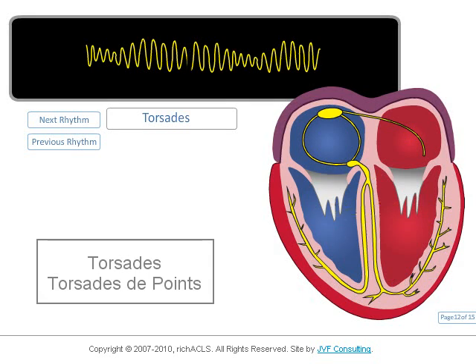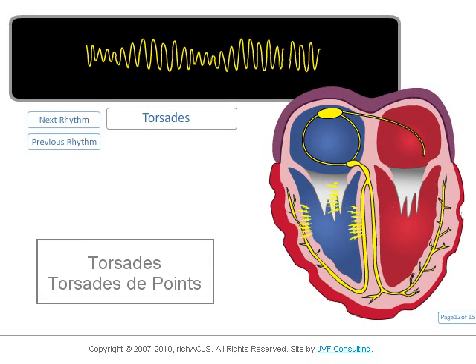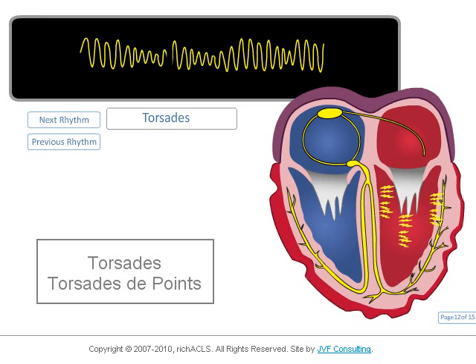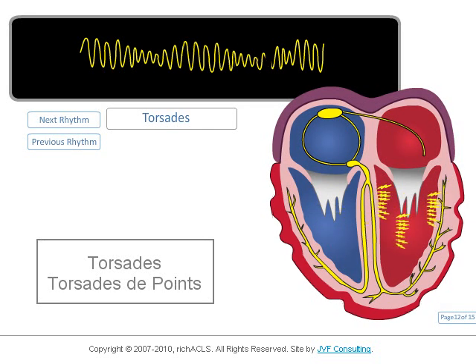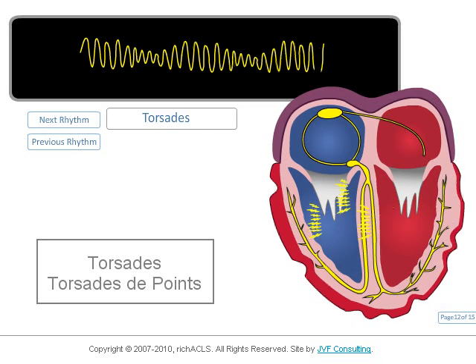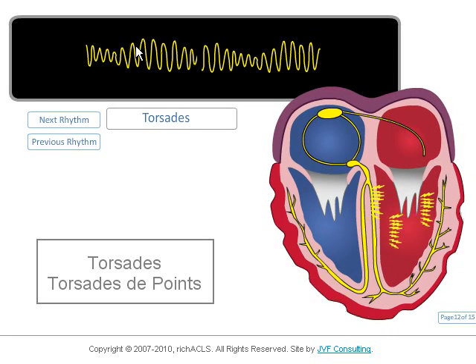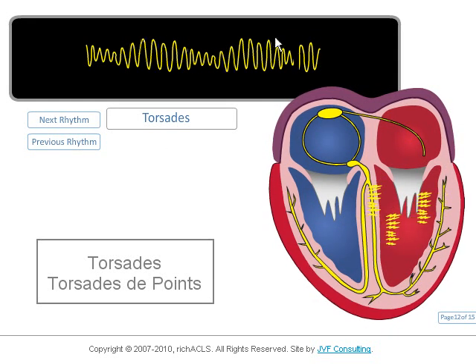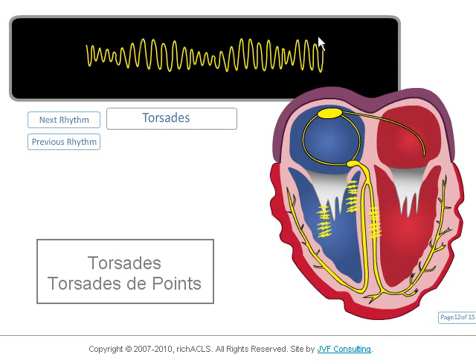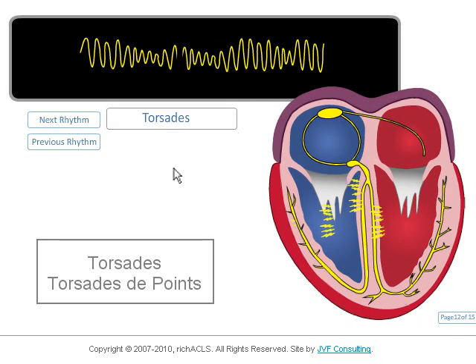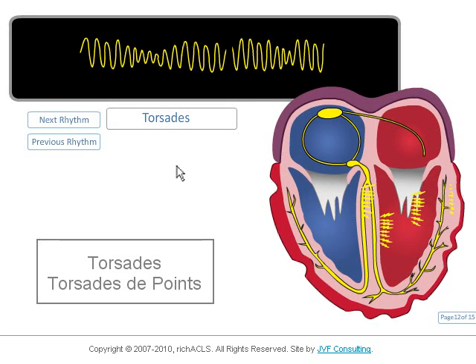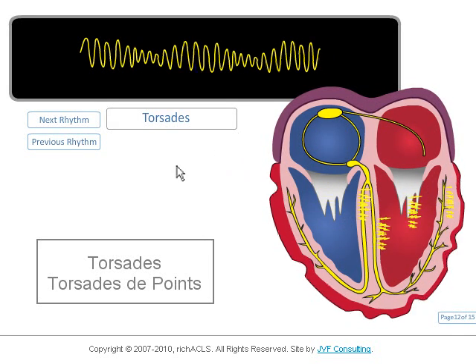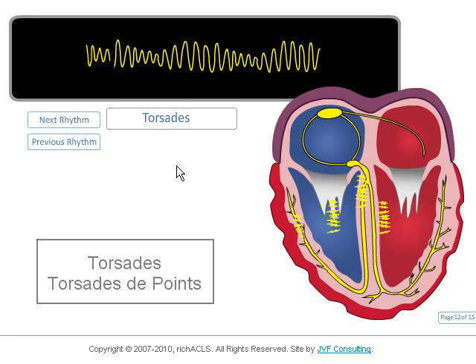Here is torsades, or more formally, torsades de pointes. This unique rhythm is characterized by a constantly changing rhythm amplitude. Torsades de pointes means "twisting of the points," which would be analogous to the appearance of a twisting DNA helix or a twisted strip of paper.